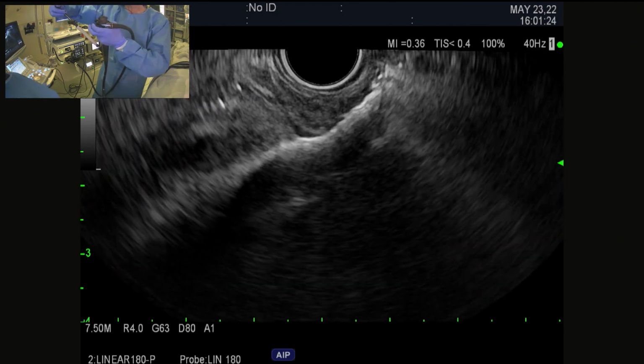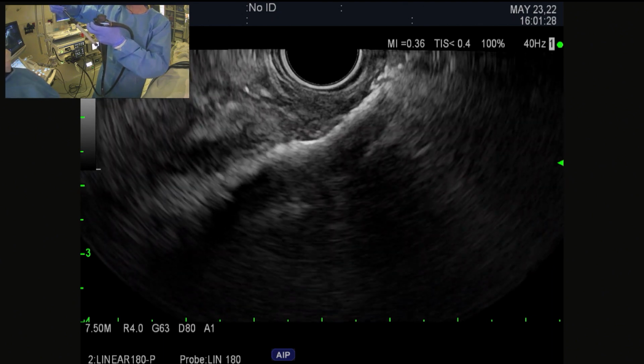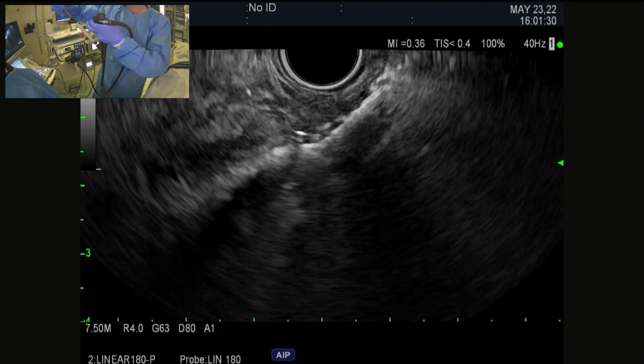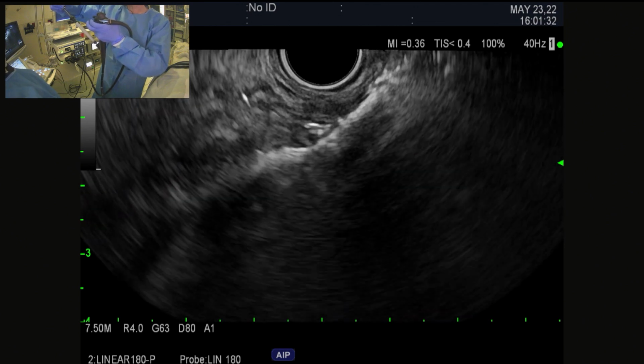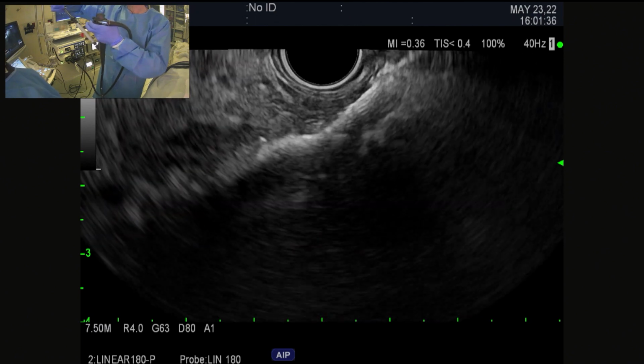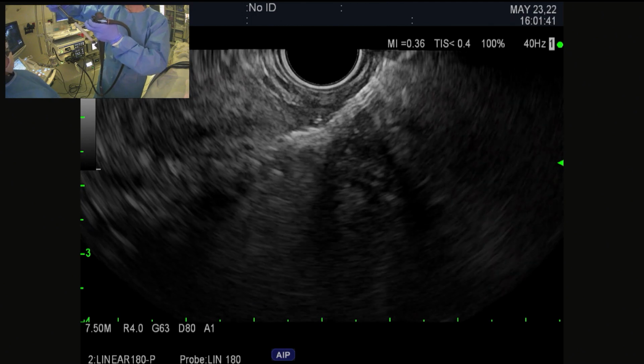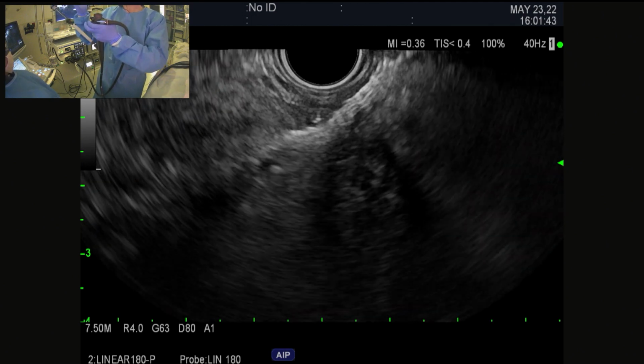While I do that, I'm watching that distal flange. I do not want that distal flange to move. And we definitely don't want it jumping forwards, and we don't want to see it pull back. So I'm pulling back, and now it's deployed in the working channel. Now I can switch to the endoscopic view. So let's get the endoscopic view up.